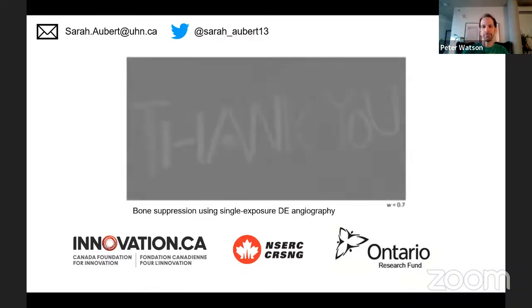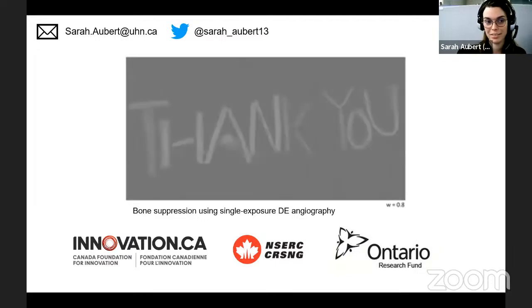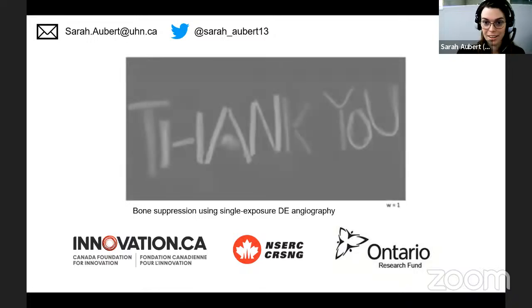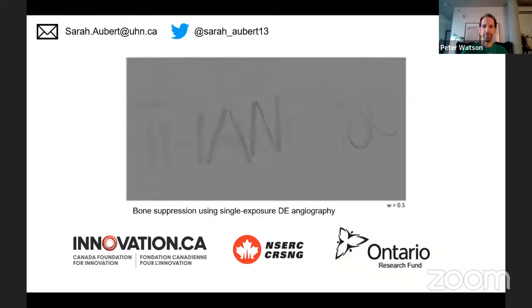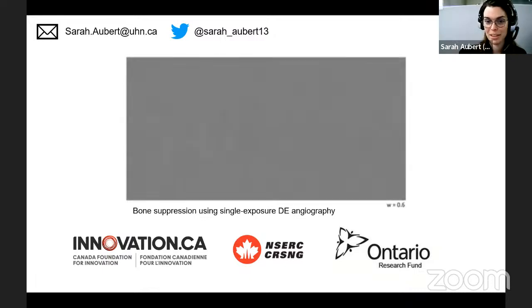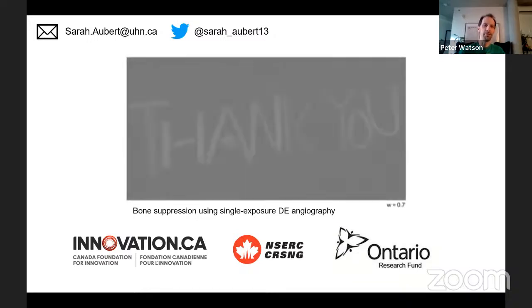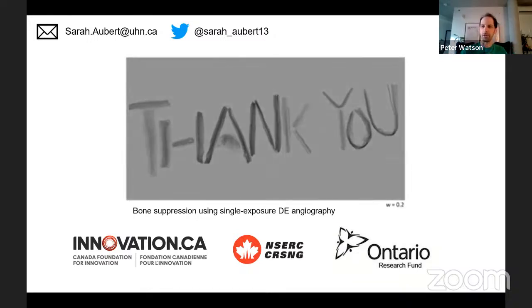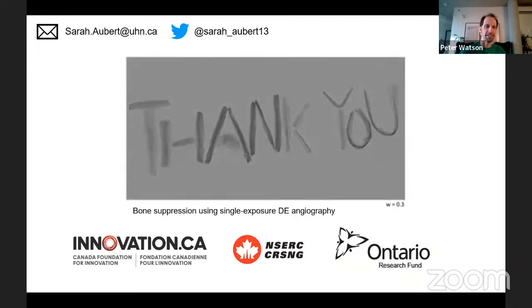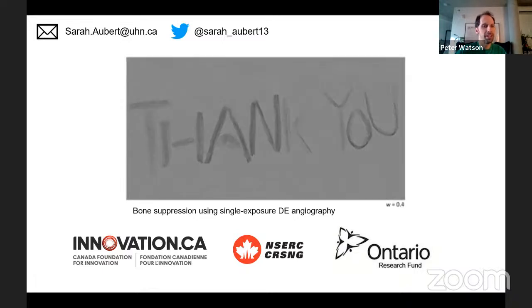Yeah, that's our hypothesis as well. Most clinical angiographic systems actually only go to 120 kV, so we went up to 150 just because it was what our system was capable of. But we do expect that as you keep going, it will plateau. Yeah, that's one thing we never really talk about, but the exit dose is going to start to get significant as the kV goes up. So that's just something I wrote down.